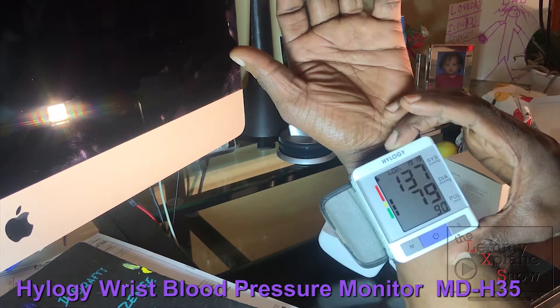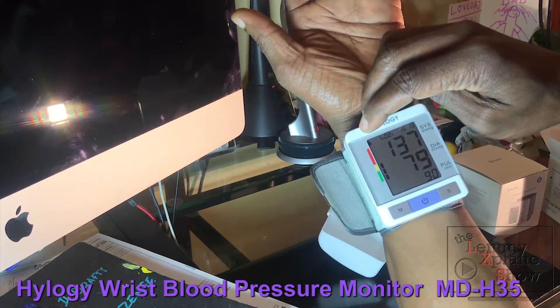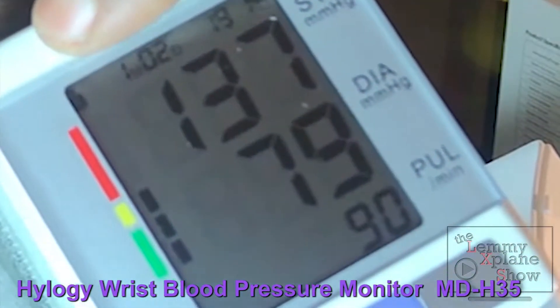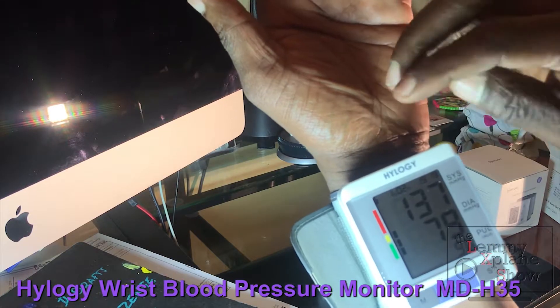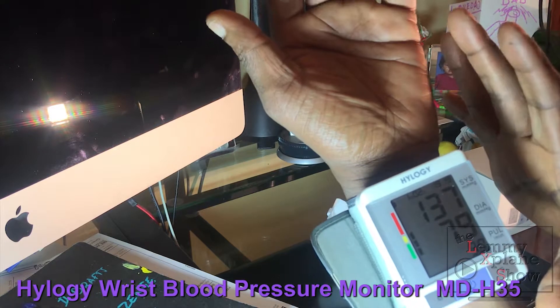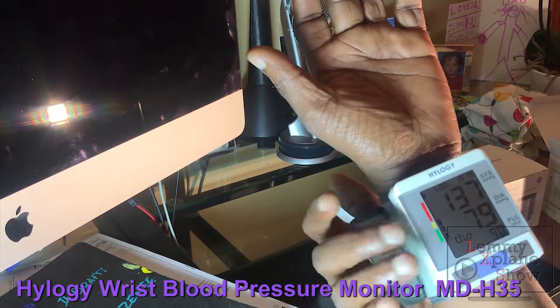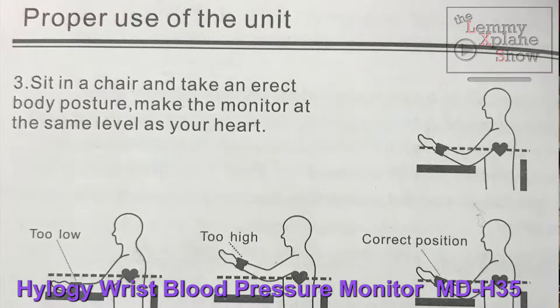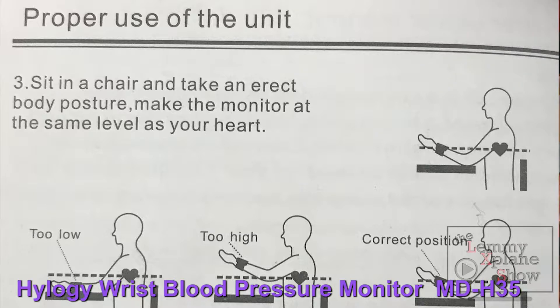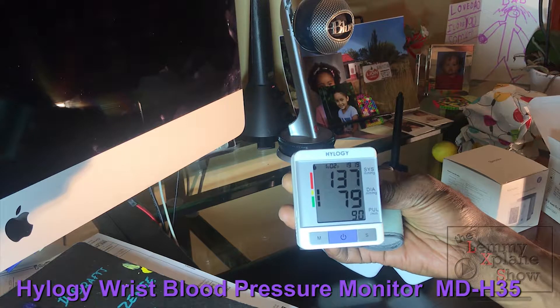The rest of it is pretty basic, just like the review I did before. You can measure two people — you can see the person symbol up there — so you can program it to store functions for two people. Basically, what you'd do once you've done a reading is take a snapshot and send it to your doctor if you don't know how to read all the numbers.